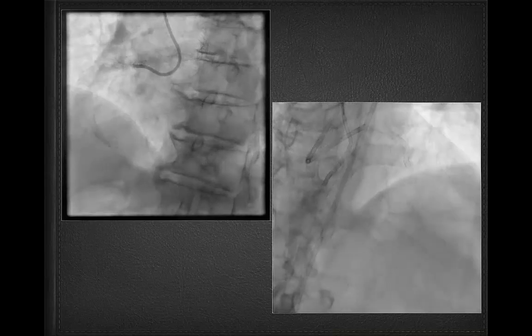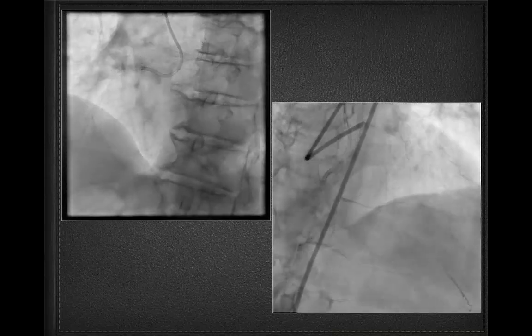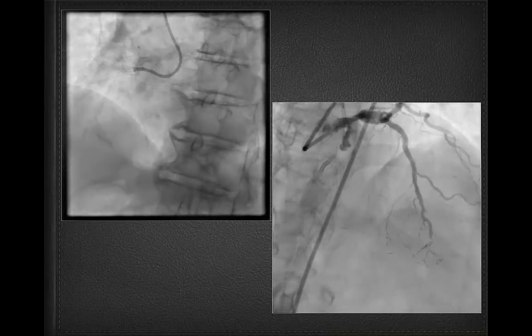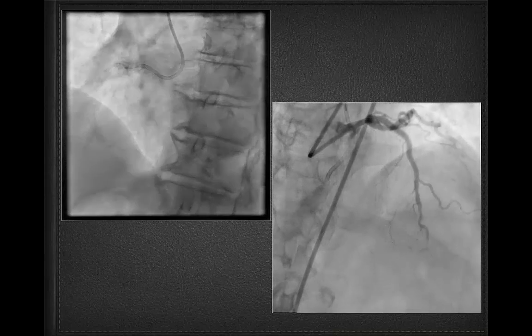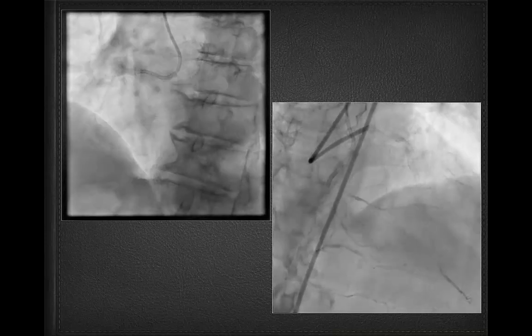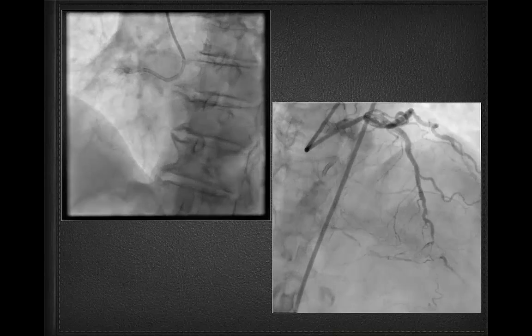So fourth case, it's also a difficult case. As I remember, you can see it's a very calcified RCA. There is some retrograde filling from the LAD, but the distal part of the RCA is very diseased also. But the patient had a lot of ischemia.